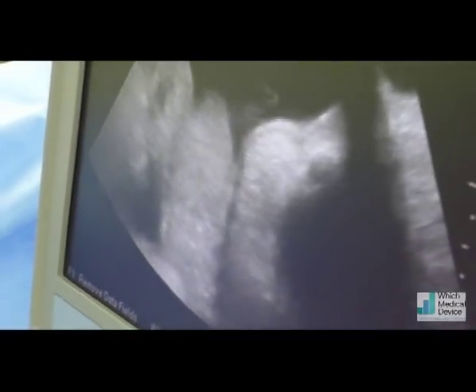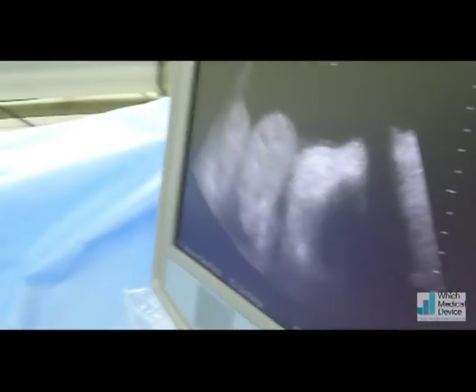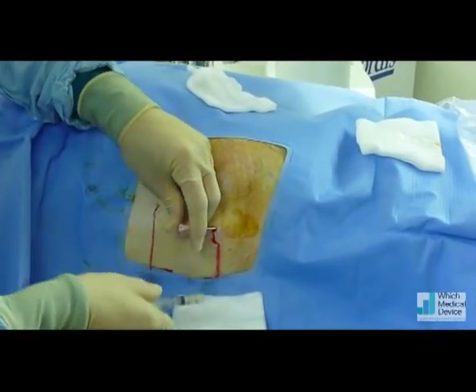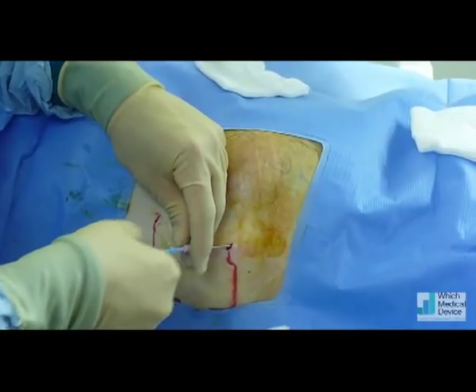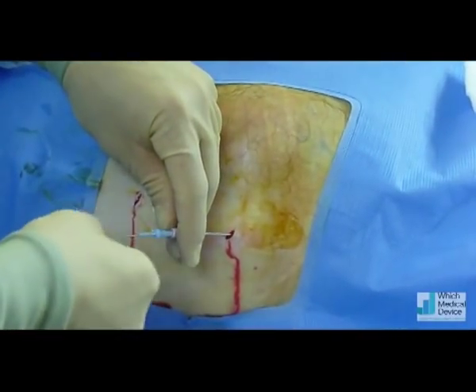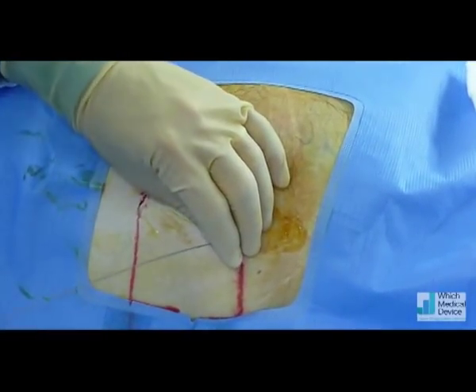Just look on the ultrasound screen here — that's the needle there. There's free aspiration of ascites. Now advance the guide wire in. It's an oblique tract, so it's in line with the catheter and it reduces any leakage as we change over. Going to leave the wire there for the moment.